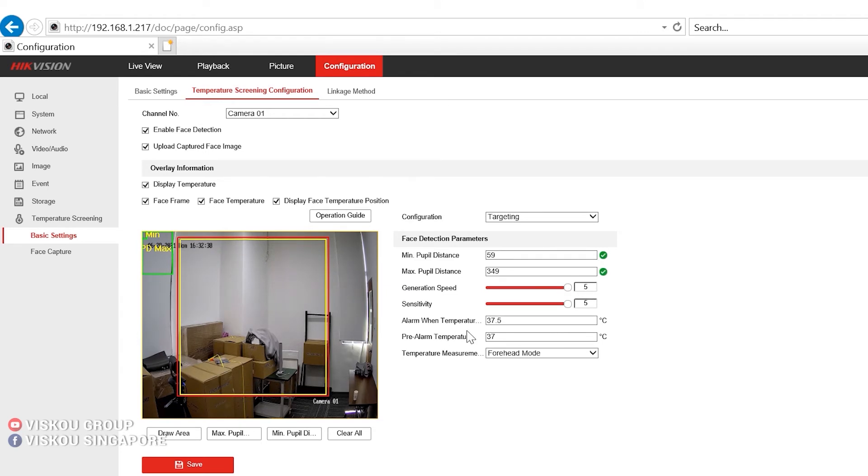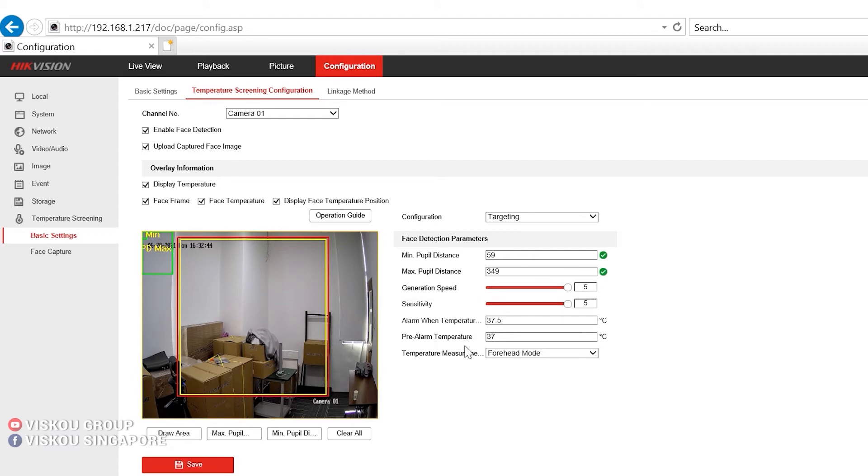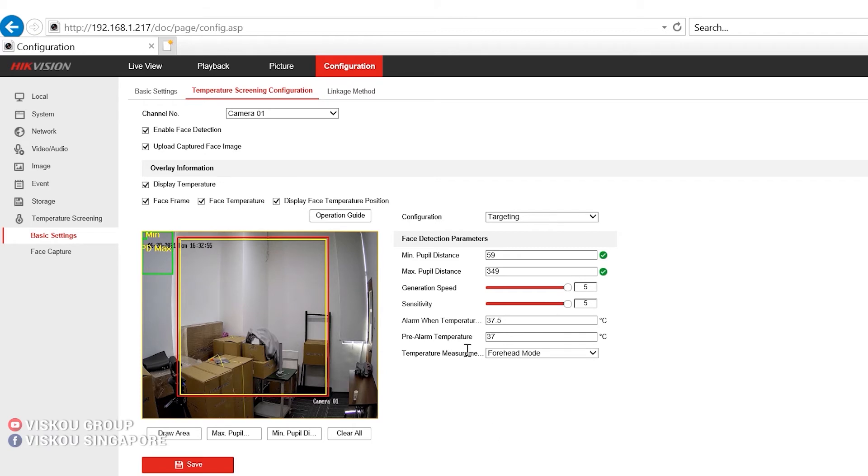The alarm temperature will announce the alarm, which is 37.5. The pre-alarm temperature you also can set over here. So once the temperature exceeds this 37.5, it will show the audible alarm and flashing alarm. So how can we set it?